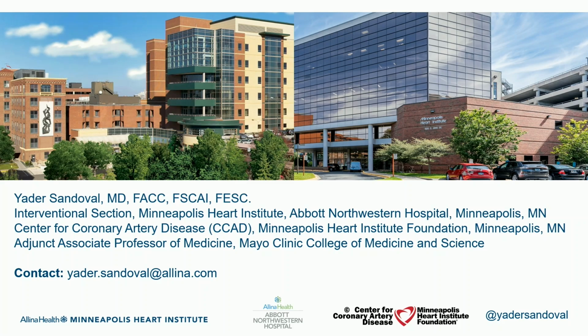The most successful outcomes trial was Prevent, and Prevent did something special. What they did was fuse two pieces of information. It was OCT guided and it was near-infrared spectroscopy guided. So you had lipid-rich plaque and you had vascular morphology, and there were sustained benefits and improved outcomes at 2 years out to 7 years. So we are entering into a new era where coronary disease is not that simple anymore. It's not just, do you have a stenosis or not. It's going to be really examining that lesion with all of the tools that we have, and I think Yader and his team are really leading that field, so congratulations to you.